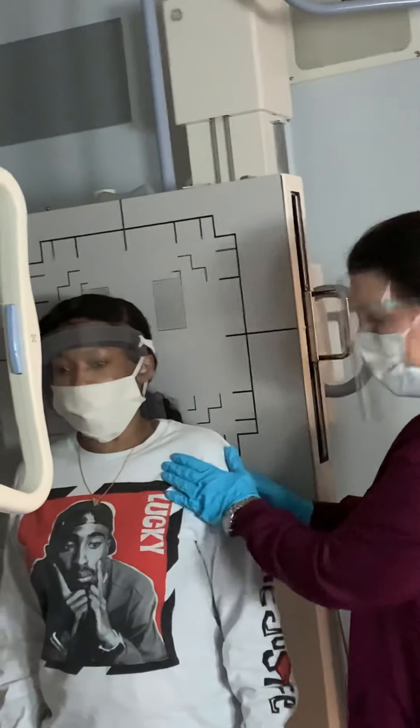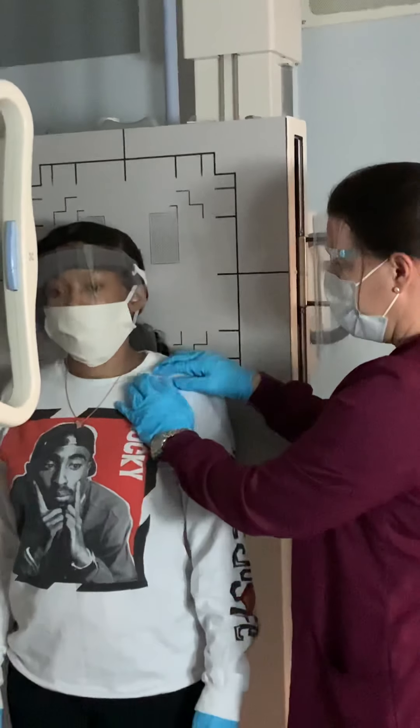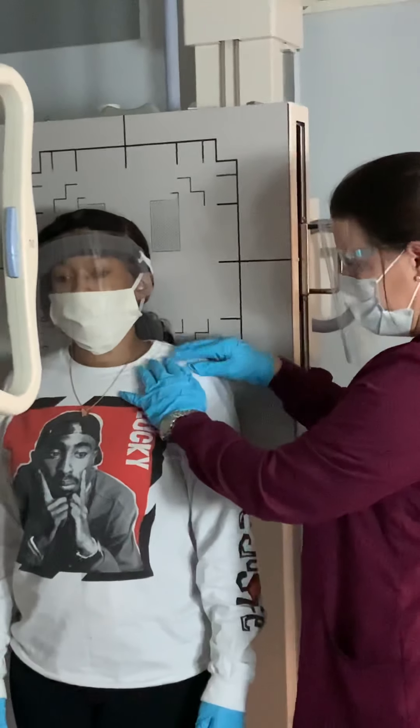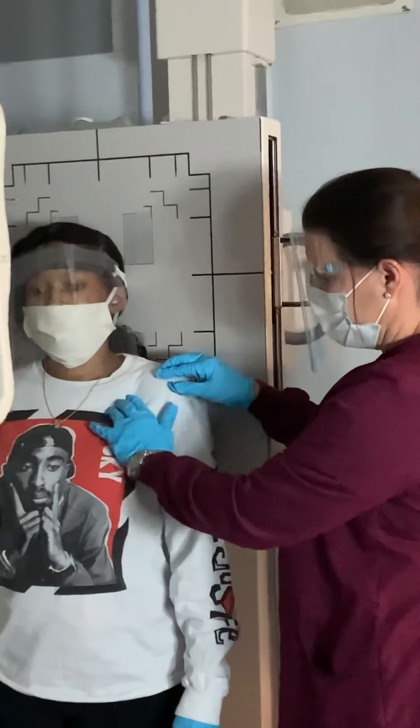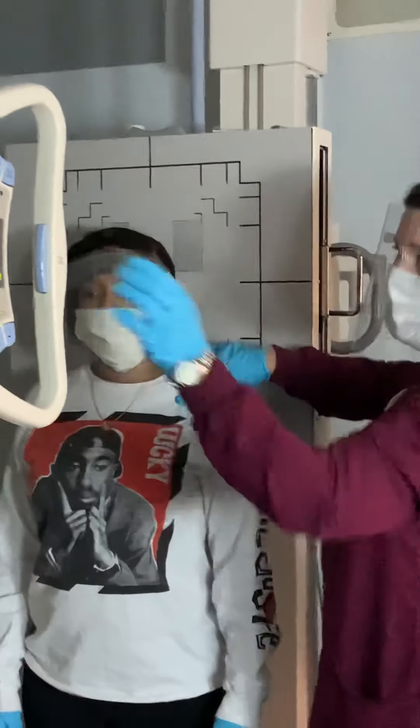Deja is hurting in her left shoulder. The first thing I'm going to do is find her clavicle, the humeral head, and that little place right underneath the clavicle is where her coracoid is going to be.